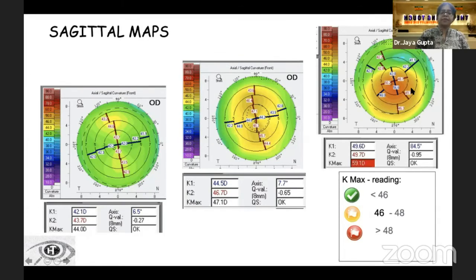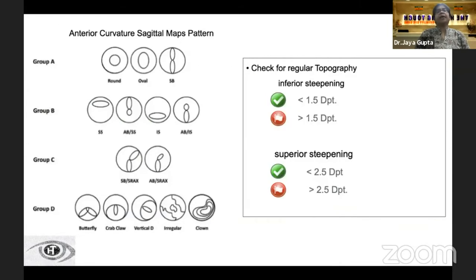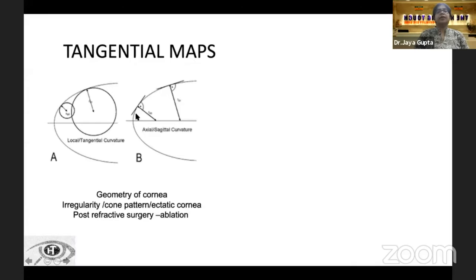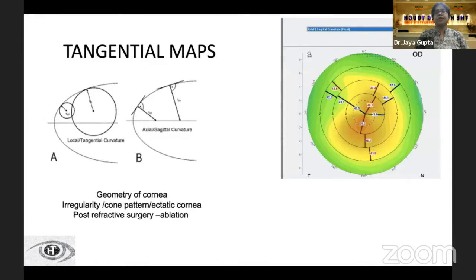A Kmax difference between the two eyes should be less than 2 diopters. The different topographic patterns include round, oval, symmetric bowtie, superior steepening, or inferior steepening. Anything beyond 1.5 diopters of inferior steepening or beyond 2.5 diopters of superior steepening is a red flag. The tangential maps are more relevant to cornea surgeons, helping identify irregularity or cone patterns, and post-refractive surgery they can be used to assess how well the ablation is centered.